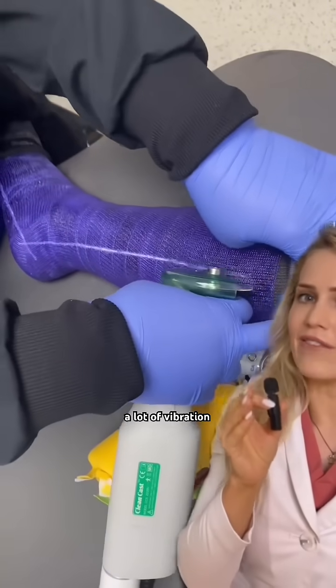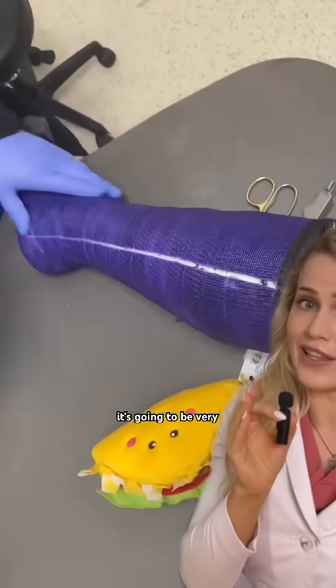You might feel heat, a lot of vibration, and it's going to be very loud, but it won't cut your skin.